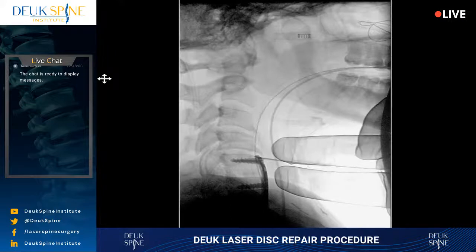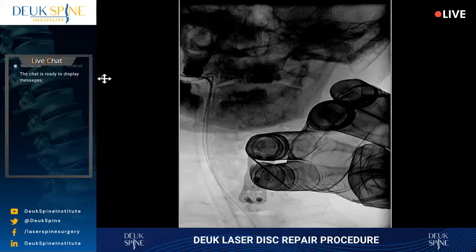Let's get an AP shot quickly. That looks pretty good. Back to a lateral. Could be a little more towards me.